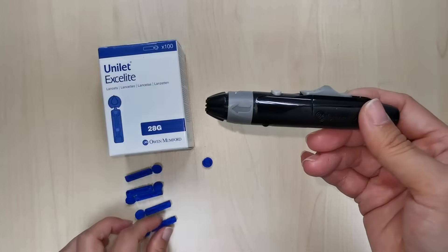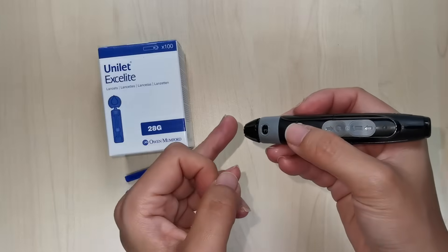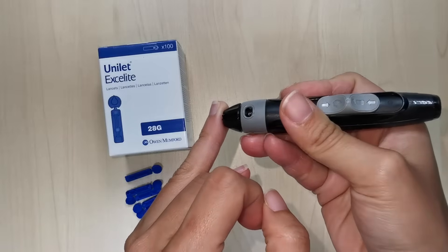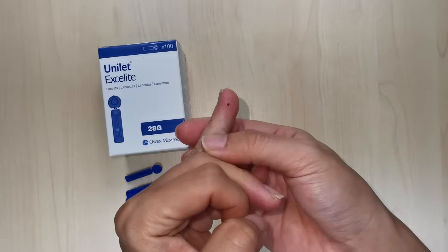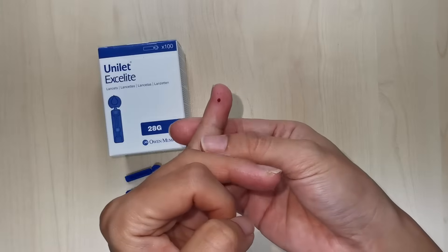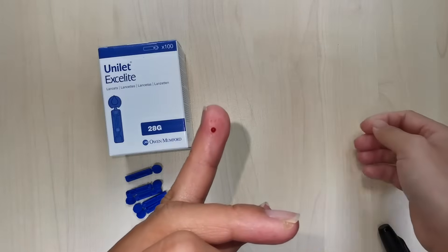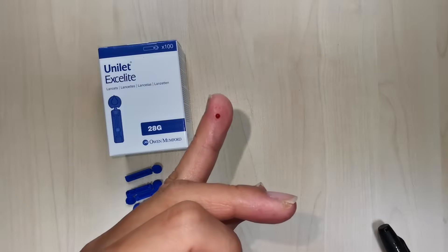To prick your finger, hold the lancing device firmly against the side of your fingertip and press the activation button. Then apply a gentle pressure near the puncture site if needed, massaging until a blood drop appears. Once there's enough blood, take your glucometer strip and absorb the drop with the strip, then attach it to your glucometer to get your blood glucose reading.